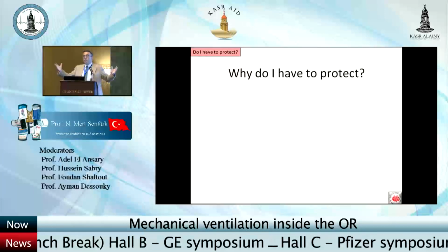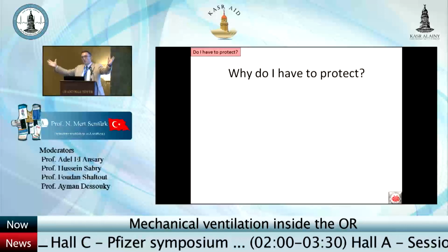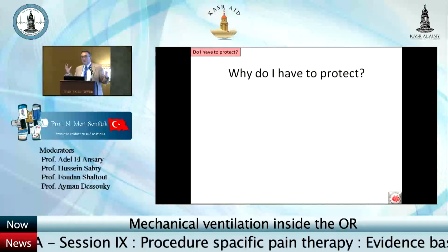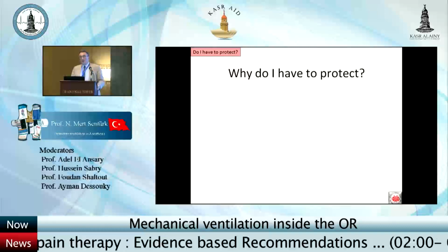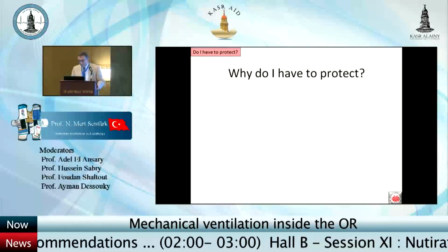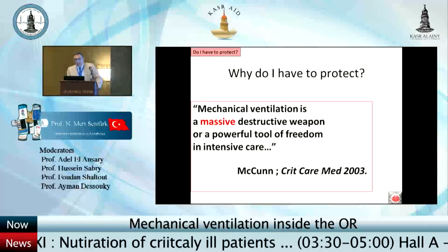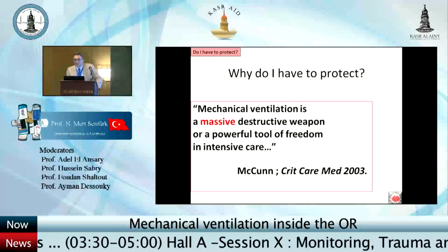But if I have to talk with all the people here, consider that you are the alveoli and I'm the mechanical ventilator. I have to change something during mechanical ventilation. I cannot talk to you all as I would talk face to face with someone. This is the main difference. Therefore, mechanical ventilation is unphysiologic, a massive destructive weapon of intensive care.